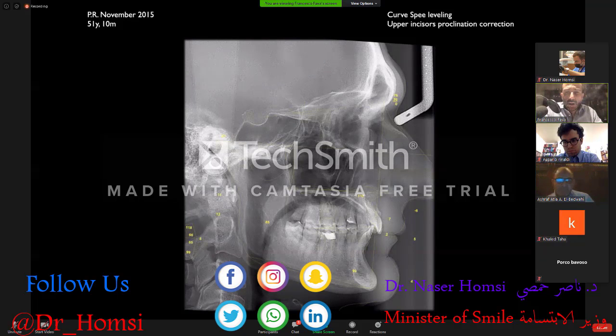When considering the importance of reducing the aesthetical impact, we can go for aesthetical braces, or maybe we can try to go to the lingual side of the appliance, and that can be an option. But if the patient does not accept any metal in his front side, it can sometimes be a problem, of course.